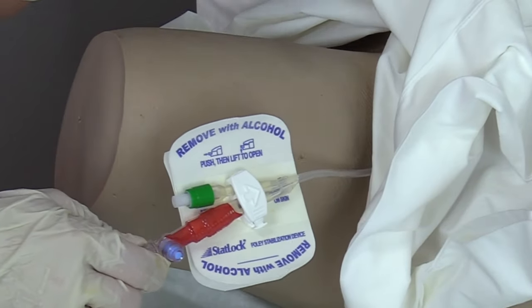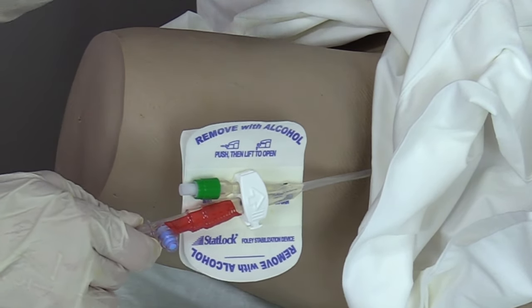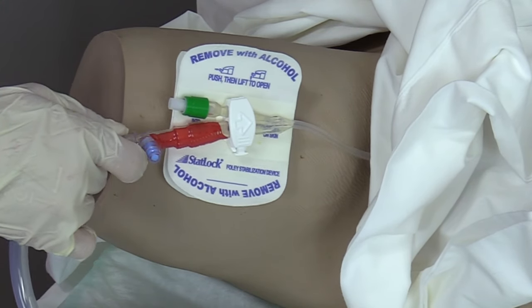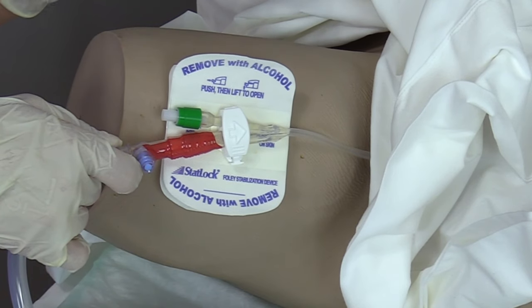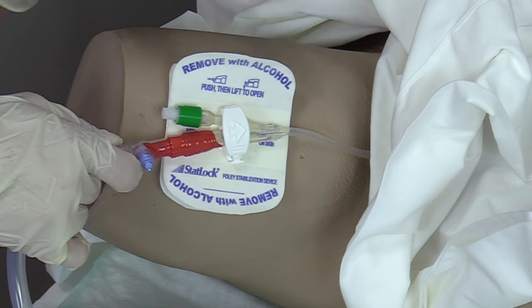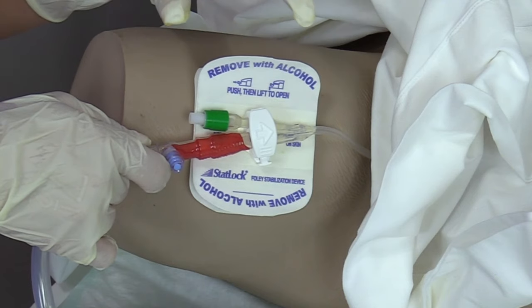Now we want to find a spot to put our STATLOK. Make sure the patient's leg is completely extended and we're going to go on the inner thigh of the female. We want some slack in the catheter line — not too much or too little. According to the manufacturer, you pick your spot and then go back about an inch, and that is about where you want to go.